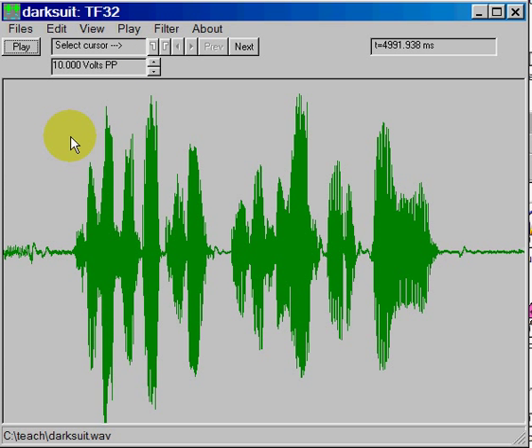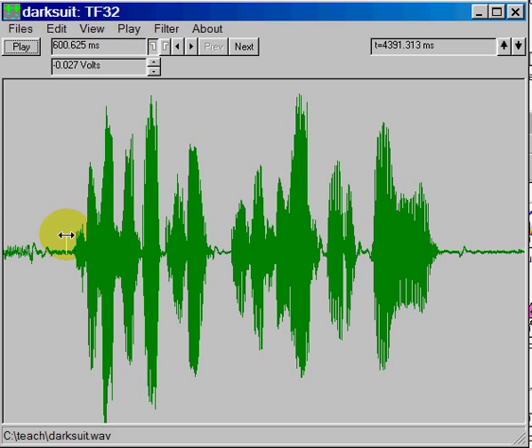In order to do that, you're going to have to make use of the cursor system that TF32 has. A cursor is simply a marker that you can place on this panel. If you place the mouse in a spot where you want to place a cursor and then hit the left button of the mouse, you will see that a vertical white line appears. If you look at the top of this white line, you will notice that there is a little hook off to the left. That denotes to you that this is the left cursor.